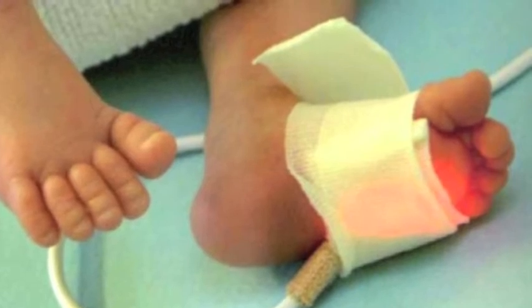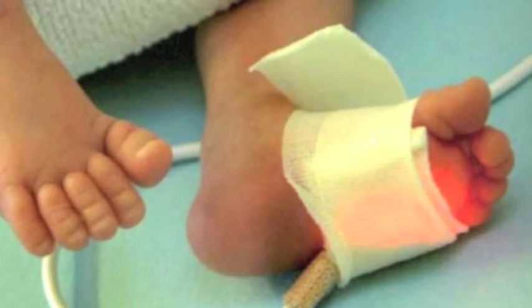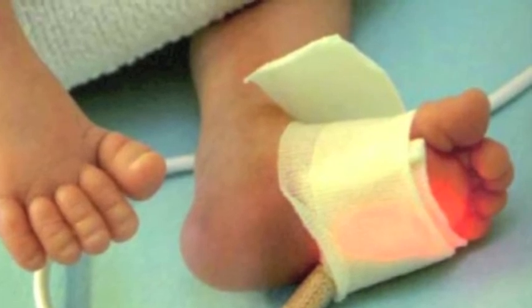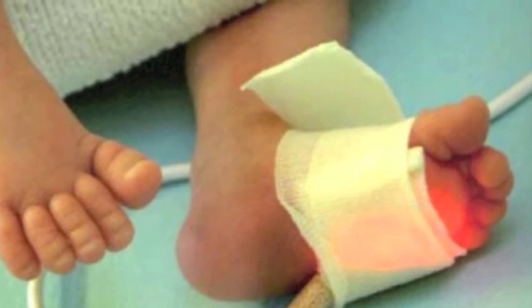A probe is placed on the patient's finger or earlobe. For babies, probes are often attached to the foot. Some sensors are disposable and are used just once. Others are cleaned with alcohol solution and ready for the next patient.